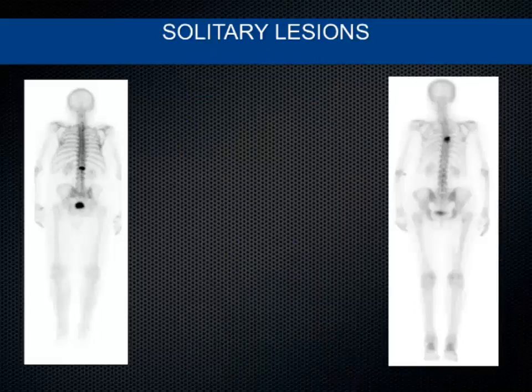Especially if it's a solitary lesion like this, then it becomes challenging, because bone scan is evolving, especially in oncology. When I came last time, we were talking about MDP, and then people said it's going to change, it's going to be fluoride. Fluoride is going to be an important aspect, but in terms of prostate cancers and other things, they're going a little bit more ahead with gallium labeled PSMA or the technetium labeled PSMA. That's going to be the future.